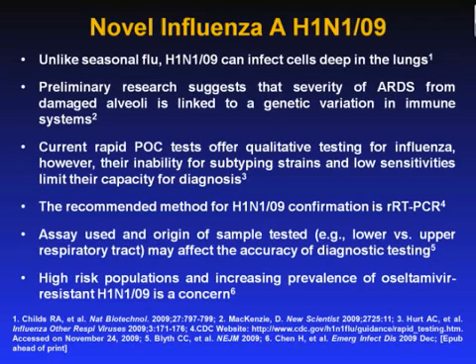Current rapid point-of-care influenza immunoassays offer qualitative testing for influenza A and or B, but generally are not capable of subtyping strains. Immunoassays are capable only of non-specifically detecting novel H1N1 virus in 10 to 70% of clinical samples, thus limiting their capacity for reliable diagnosis.